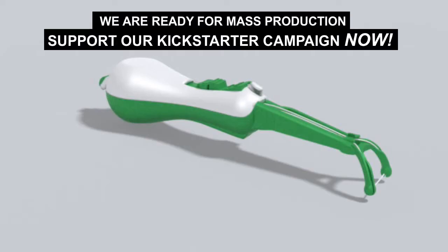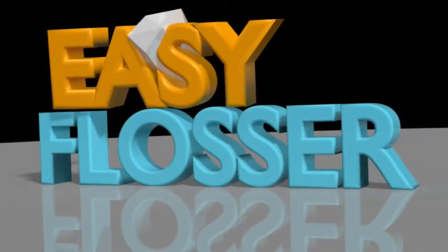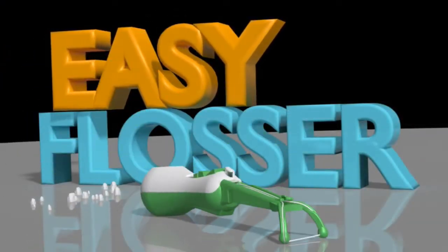Support our Kickstarter campaign now. Easy Flosser — the easier way to floss.